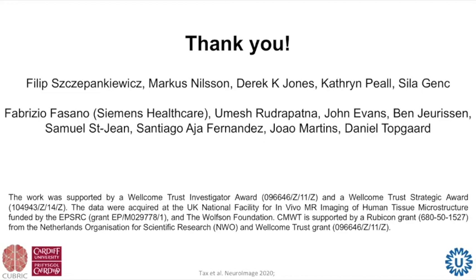We just tried to do the best we could, and I believe that there are some papers showing that in certain circumstances with this adaptive combine, it does converge to approximately a Rician distribution. But I think the suggestion of keeping careful track of the noise is definitely something we should do, especially when you look at such low signal. Yeah, it's pretty important to know where that noise floor is, so you can determine that it's a plateau. Yeah, you really need to know.